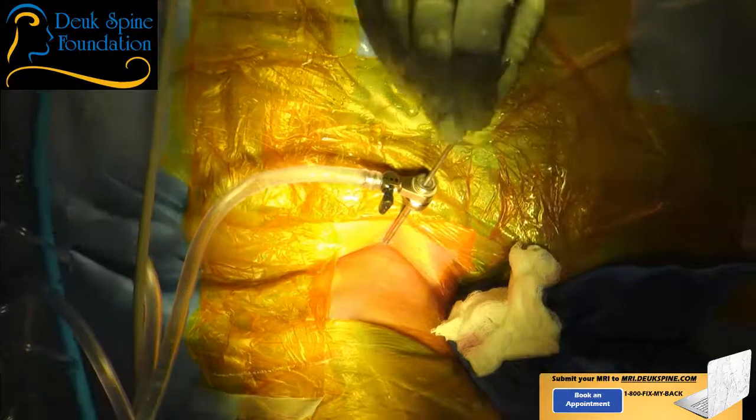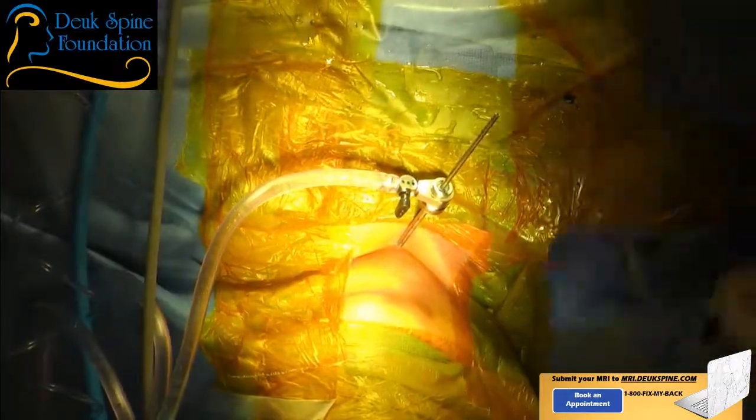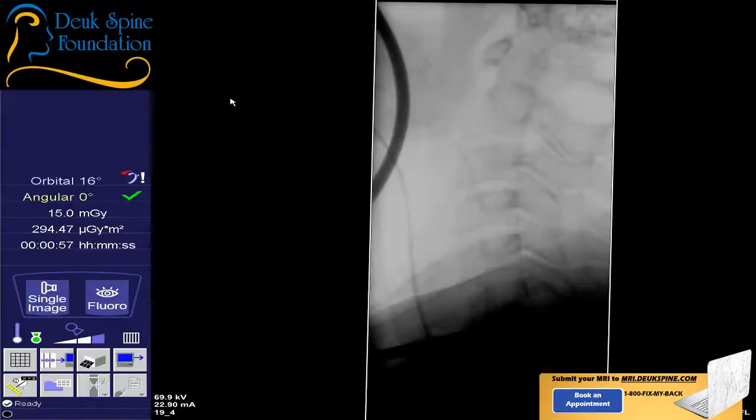All right, that's two discs down and one more to go. So for this one, we're going to need some help with the shoulders one more time, but just briefly. I will need the AP and laterals. No, only need lateral in the beginning. So I want to just do a lateral until I get the dilator out and moving, and then I want to start getting some quick APs.